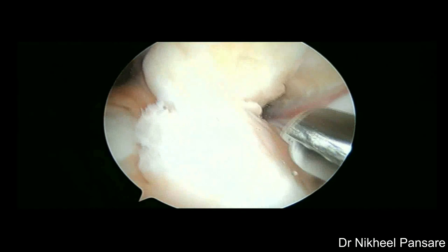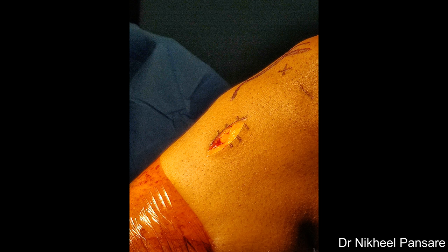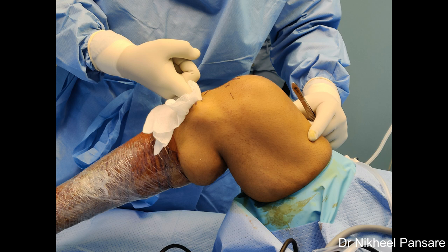Now we will start harvesting the hamstring graft. A longitudinal incision about 3 to 4 cm is taken, centered on the anteromedial surface of tibia starting from the level of inferior margin of tibial tuberosity. Most of the times a small vein is encountered passing across the incision, which confirms the placement of incision. Cauterize and dissect subcutaneous fat with a 15-number knife. Blunt dissection is carried out with fingertip covered with a thin layer of gauze piece. Expose the fascial layer overlying PES attachment. Palpate semitendinosus and gracilis tendons by rolling your fingertips — the thicker tendon is always semitendinosus.